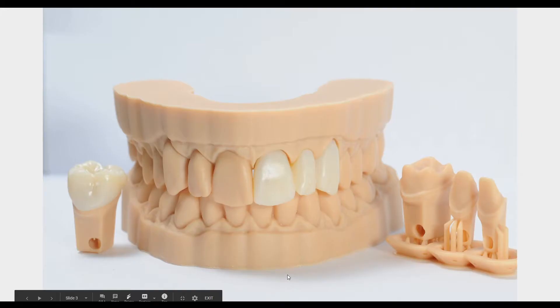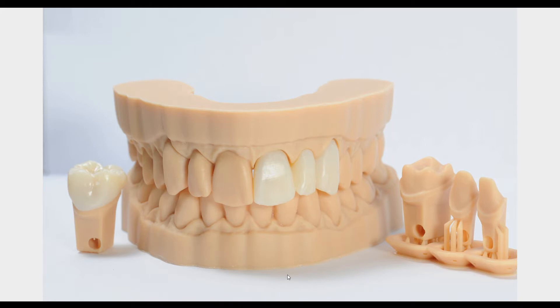The goal for this video is to show how to make solid models to check contacts and occlusion with extra working dies to finish down margins and work on the restorations themselves. So let's get into it.